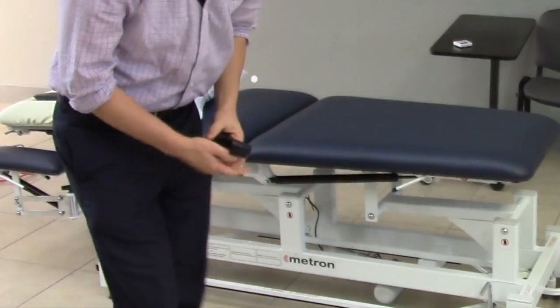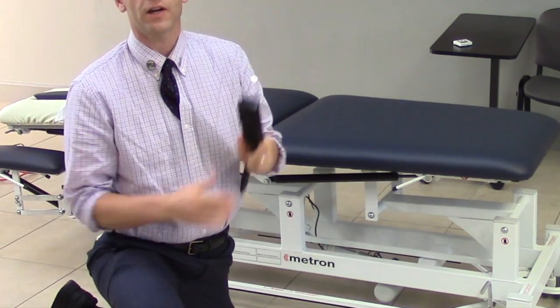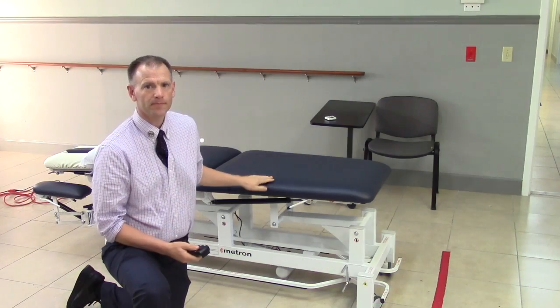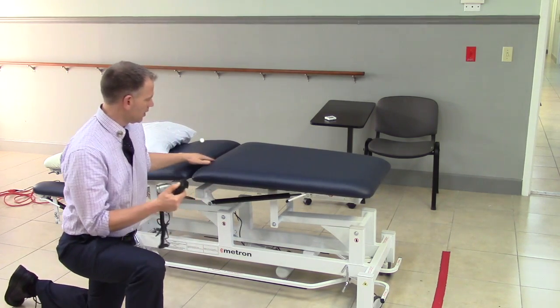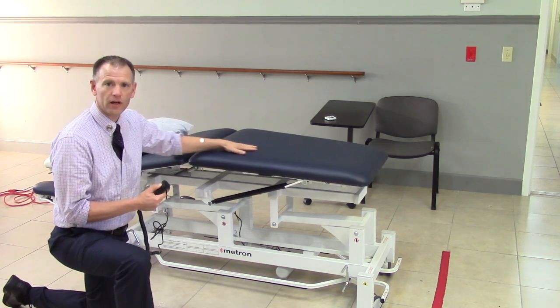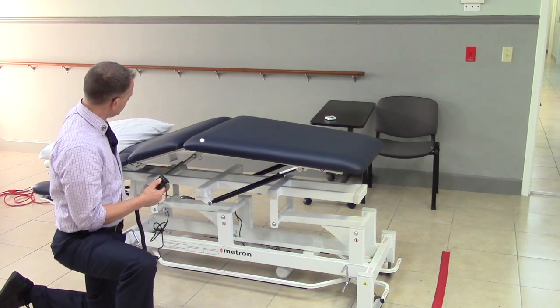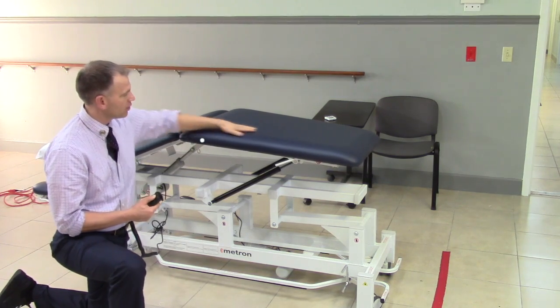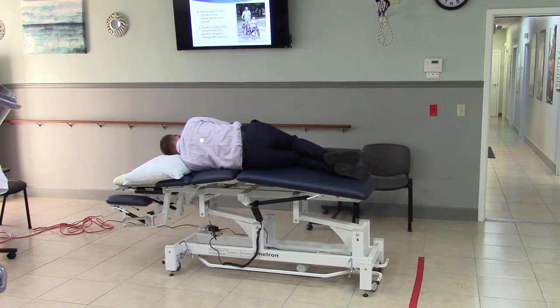Next we're going to look at the handheld control, which controls the center section of the table. There are two buttons on the control — one for up. You can see the center section raising up; the back section will also raise. This is left side bending — you can add a little rotation as well, good for positional distraction or mobilization.